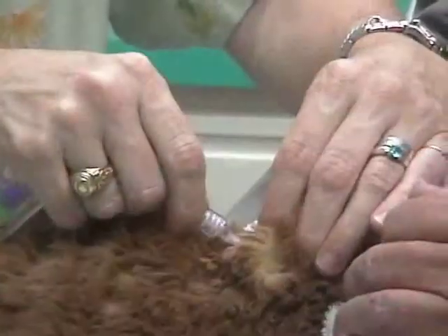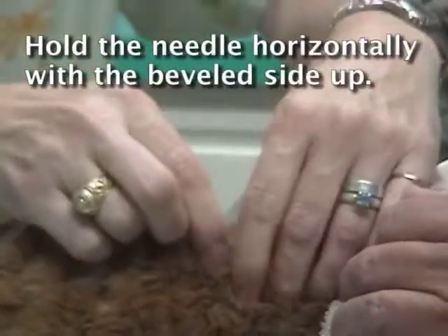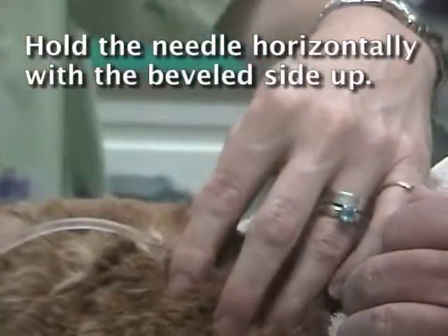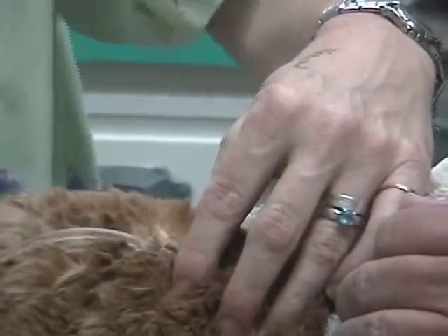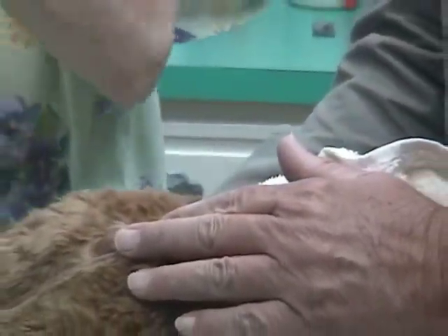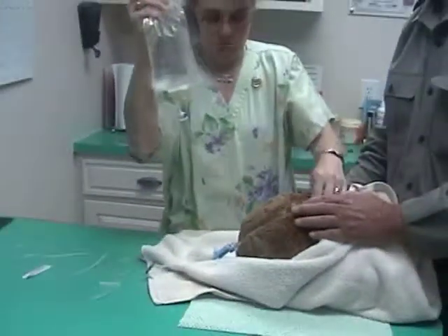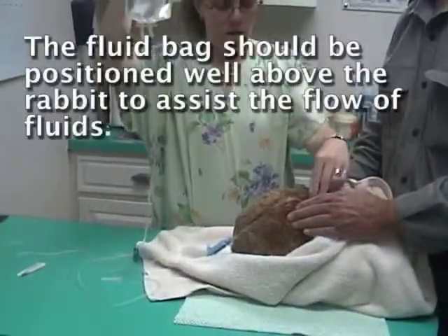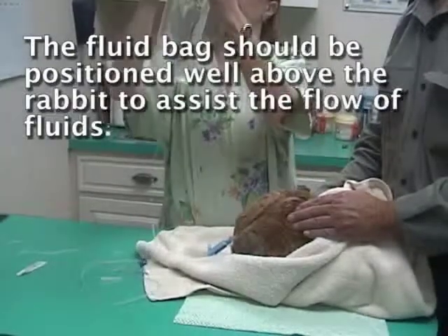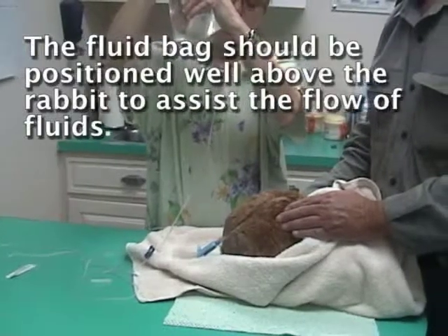You pick up the skin and make a tent with the skin, and then you pass the needle under the skin but not into the muscle. You open up your line. It can go full open. Make sure all your clamps are open. And then you start passing the fluid underneath the skin.